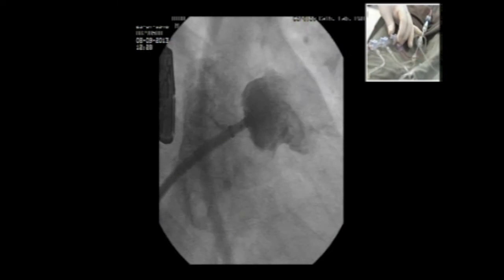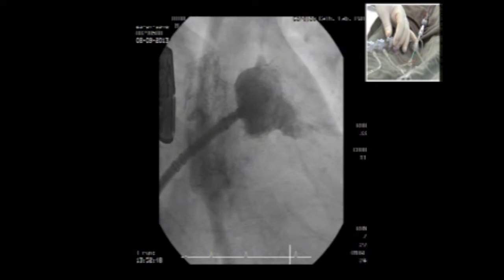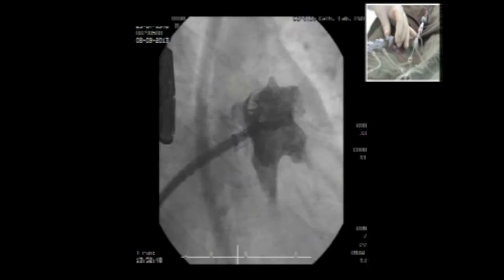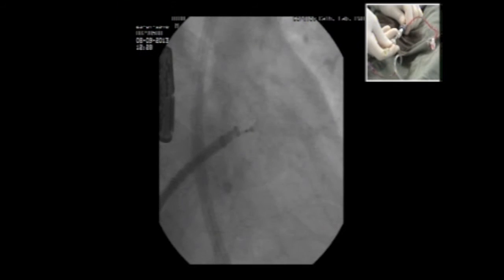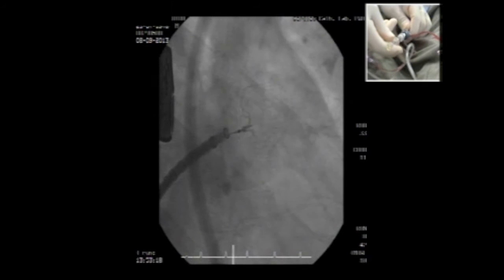Dark contrast. Okay, so what could happen is that the distal anchors are caught by some trabecula, and that's why I cannot recapture it. Let's do it. Yeah. You see? Okay. It's quite stable. Sorry, I need to inject contrast. Yeah. Let's do it again.